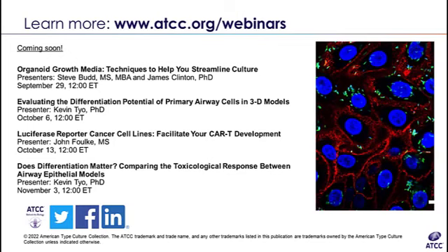In general, we do recommend not going, I would say, more than 10 passages beyond an original seed vial. Extended passaging can cause genetic drift. It can cause changes in, or rather, a selection of a subpopulation of cells. So, while they can go on indefinitely, for homogeneity purposes, it definitely is more worthwhile to try and keep that within 10 to 15 passages from the original vial that you created the seed stocks from.